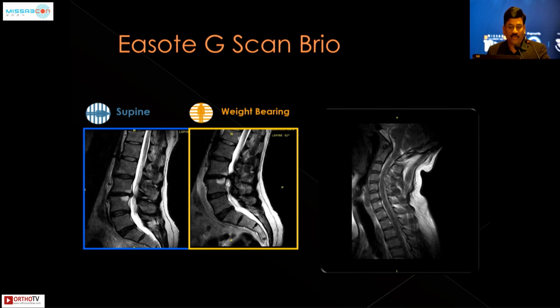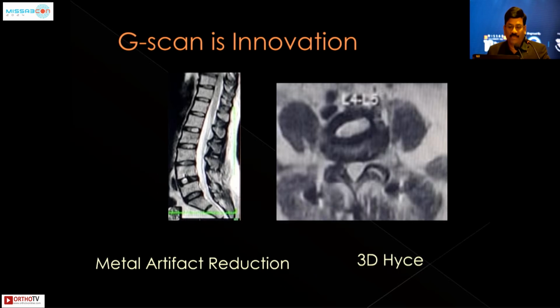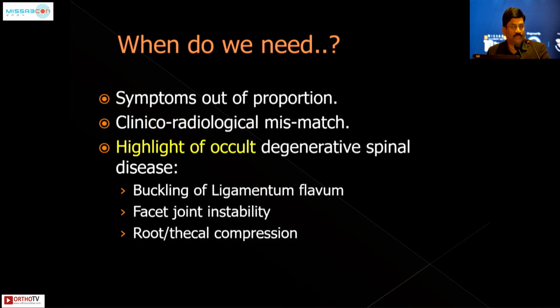SOT has come up with these things, which can make the patient quite comfortable, with metal artifact reduction, and can even acquire images faster. The issue with previous weight-bearing MRIs is that they were slow and the resolution was not so good, but this has been improved.